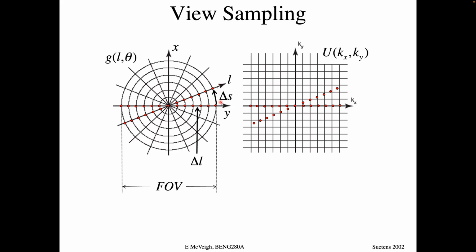So the question is, where are they equal? This distance from this sample to this sample, if I call it delta S, at what radius does delta S equal delta L? That's a match between our sampling rate on the detector and the number of projections required to make a sampling density along this arc that is the same as the sampling density along this projection. And so therefore I can reconstruct a sufficient sampling inside that field of view.